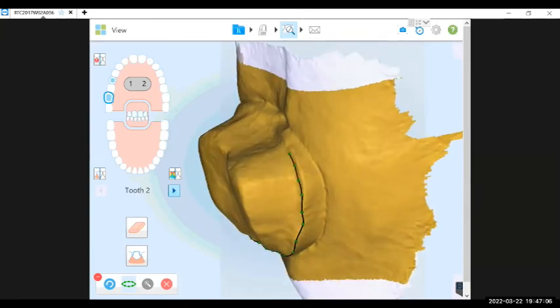Great, thank you. Here's another question. Does the scan get sent to iTero and then they choose the margins rather than the lab? I'll take that answer, and it's a yes and no sort of answer. So there's something called iTero modeling and interpretation. So the files go through modeling and interpretation, and they have the capability to remove layers of data, right?